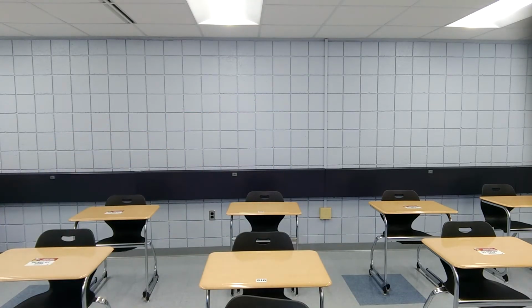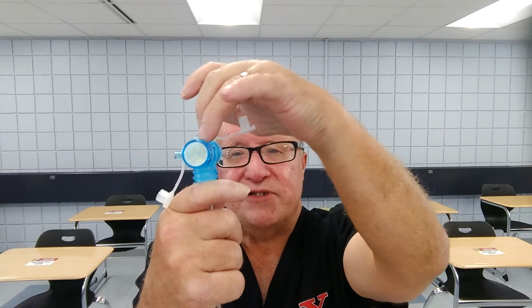Again, you don't want to just put it on there and have them breathe directly, because the numbers you get will be erroneous. Now, when I do that, I'm going to position this so they're breathing in through this valve and out through this valve.